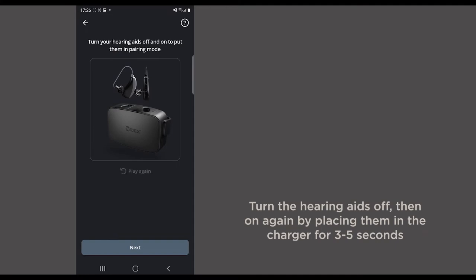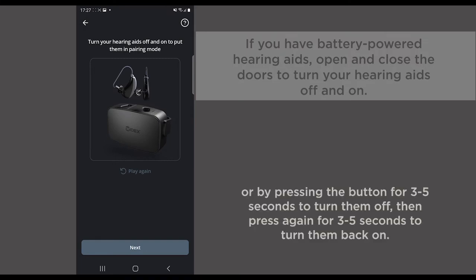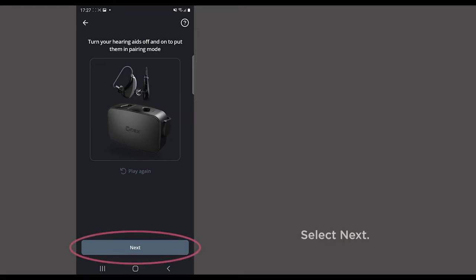Turn the hearing aids off, then on again by placing them in the charger for 3-5 seconds or by pressing the button for 3-5 seconds to turn them off, then press again for 3-5 seconds to turn them back on again. Select Next.